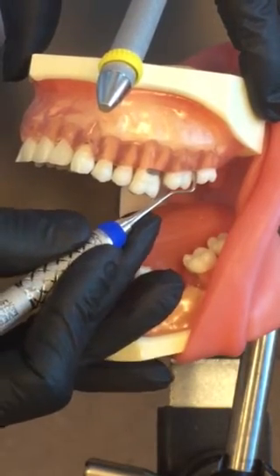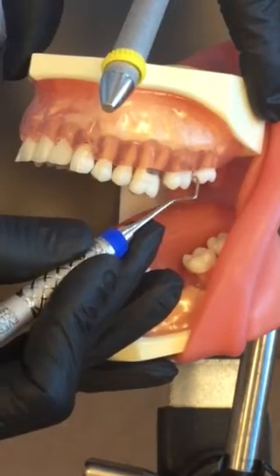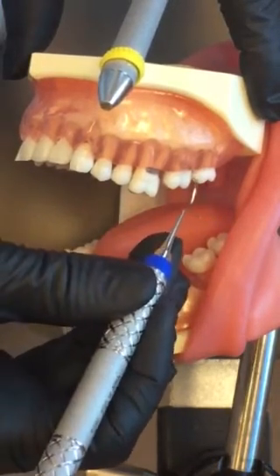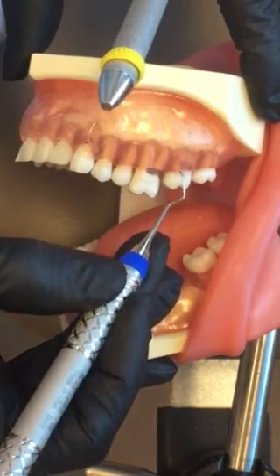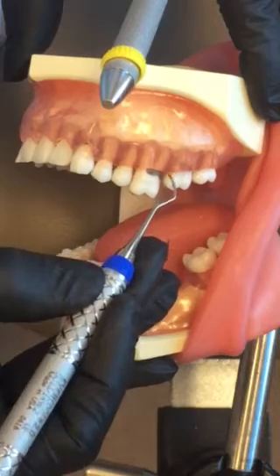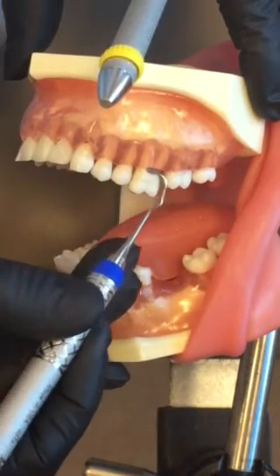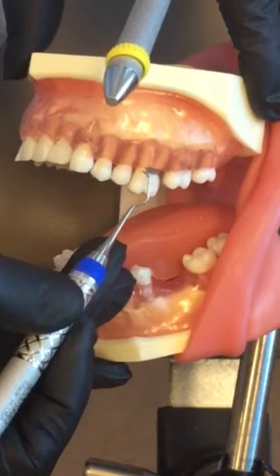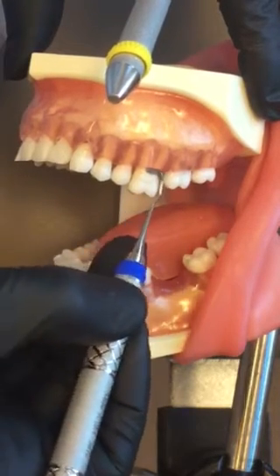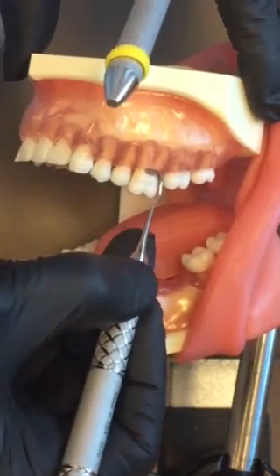Distal line angle in and around. On your typodont you're going to catch — this is easier on a real person. Roll from the distal line angle across the buccal, roll around the mesial line angle. Again, distal line angle in and around. Roll mesial line angle removing deposits, making sure you're getting apical to the deposit — meaning underneath. Then apply your lateral pressure and remove the deposit.